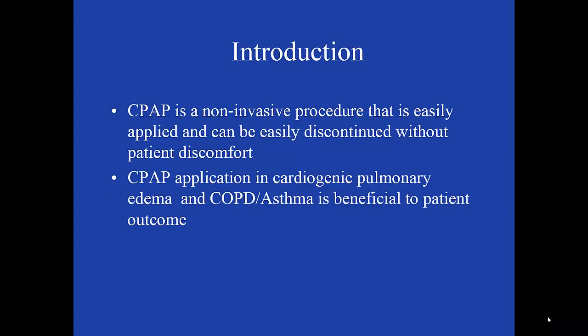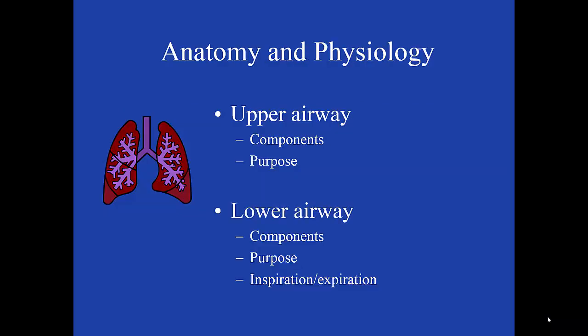So CPAP is a non-invasive procedure. It's easily applied and discontinued without much discomfort to the patient. CPAP application is useful in a variety of respiratory complaints, including pulmonary edema, COPD, and asthma. So let's take a look at the anatomy and physiology of the upper and lower airways.